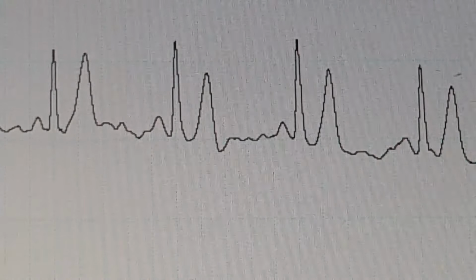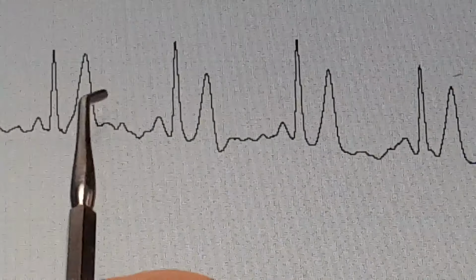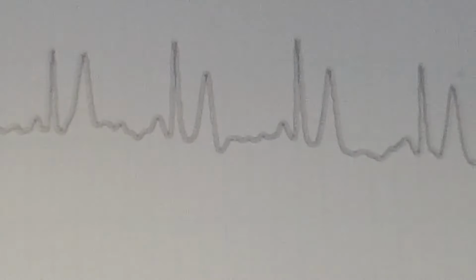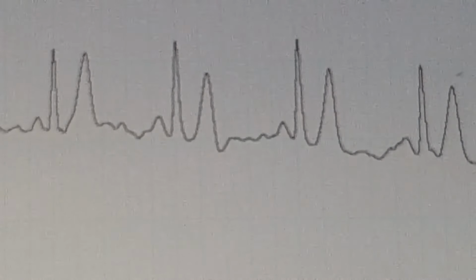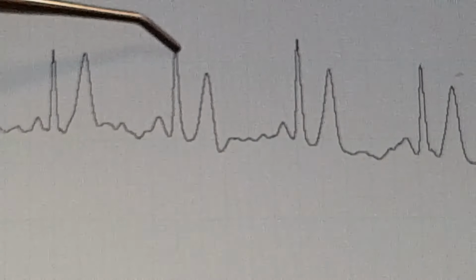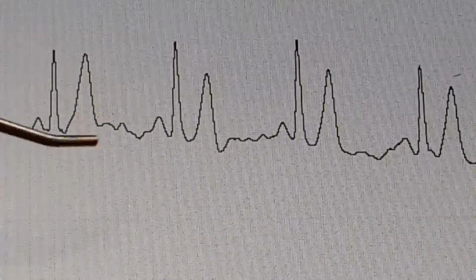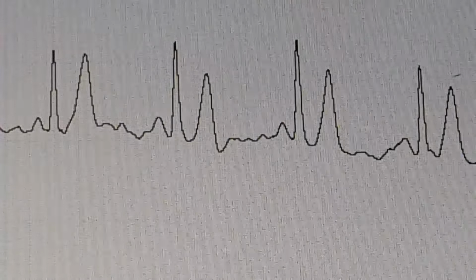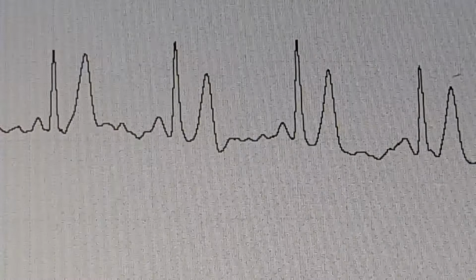So each one of these trio of waveforms, PQRST, represents a cardiac cycle, at least in the electrical sense. You will notice there's no waveform showing me atrial repolarization. I'll leave that for your lecture instructors to describe for you, why that is. But for lab, what's this called? P wave. What's this called? QRS. What's this called? T wave. Now, yes, you notice my T waves are very tall. That's not that unusual. So this is a perfectly normal looking ECG, and not a bad one, given all the electrical noise that's in this room.